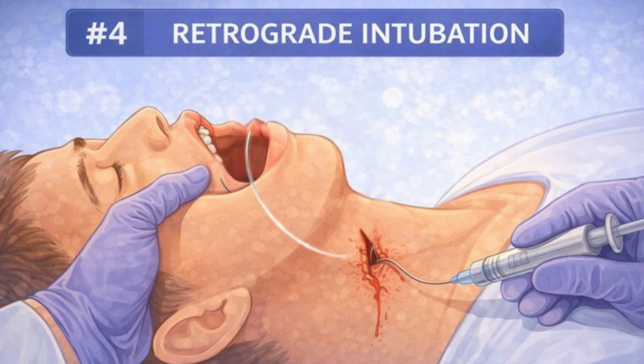But what if the airway cannot be visualized, yet there is still time to avoid cutting the neck? Retrograde intubation is used when the upper airway cannot be visualized, but the trachea is still accessible. This technique does not start from the mouth. It starts from the neck.